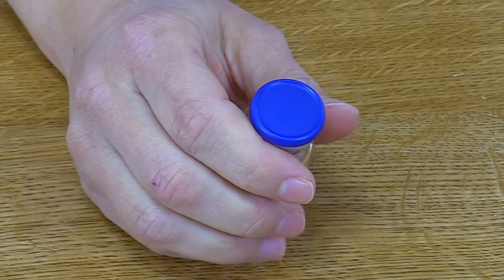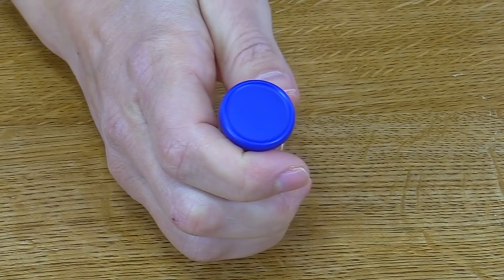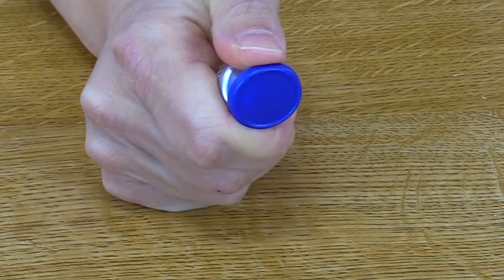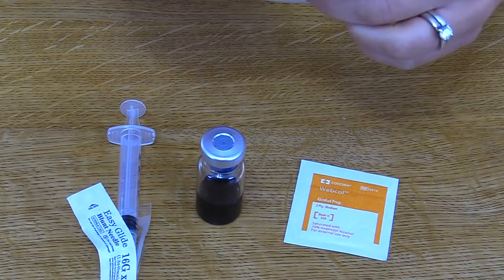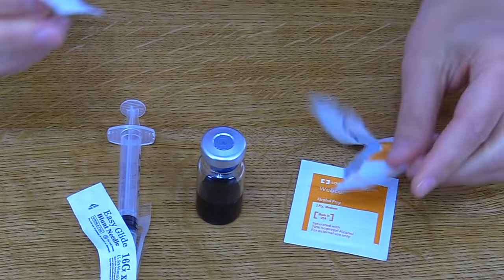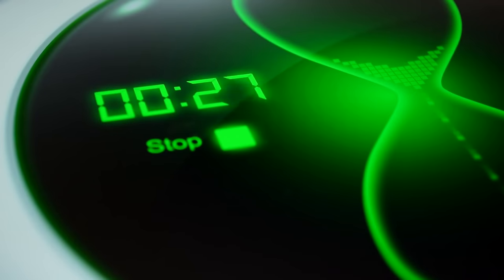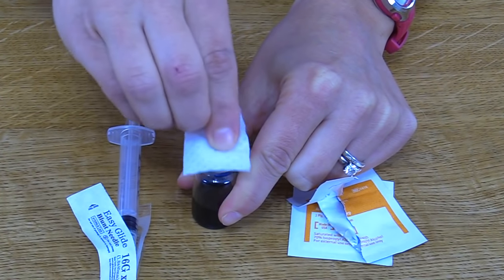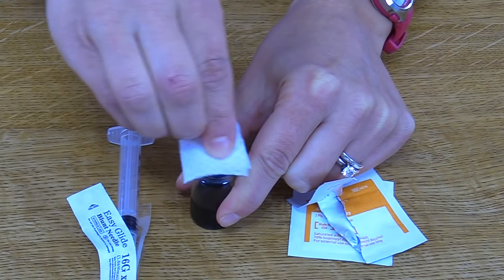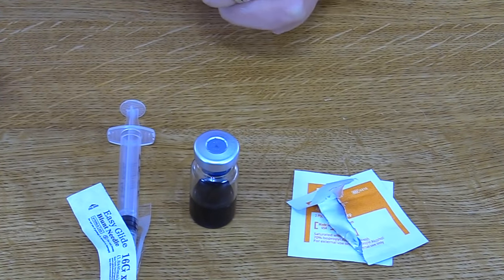Next, prepare the vial for medication withdrawal. Flip off the top of the vial if it's present. Then open an alcohol prep pad and clean the exposed top of the vial for 30 seconds, scrubbing it to help decrease any contamination. After doing this for 30 seconds, let it completely dry.